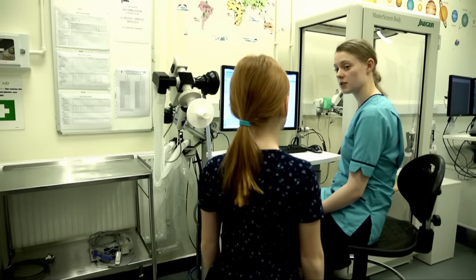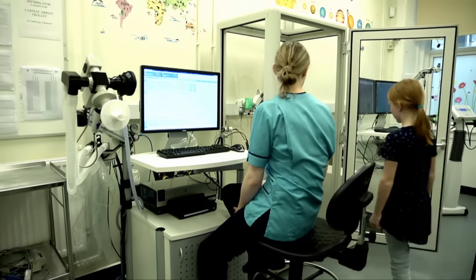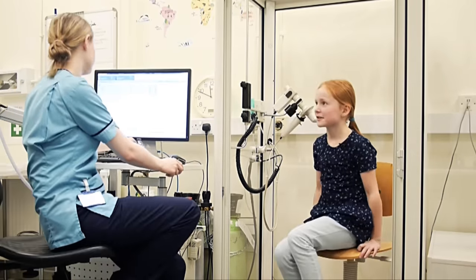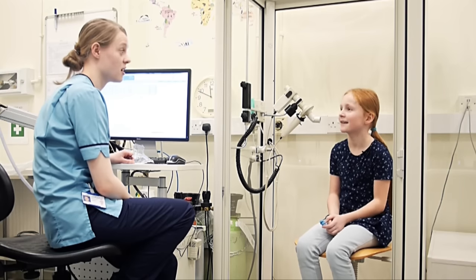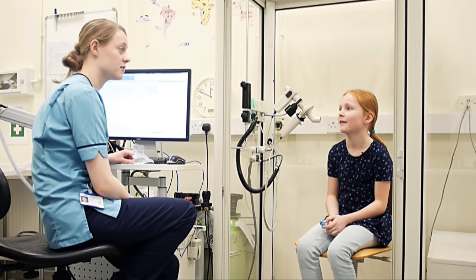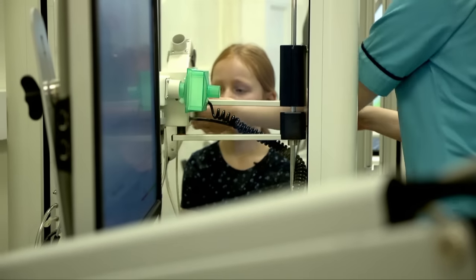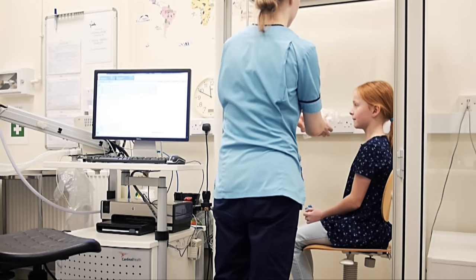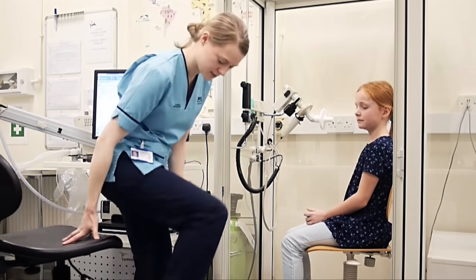So I'll get you to come across and have a seat in this box. Okay, have a wee seat up there for me. This box looks a bit like a TARDIS. What is it for? Well, the box allows us to measure how big your lungs are and how well different parts of your lungs are working. So if you want to turn around and face the other way, and I'm going to put this mouthpiece in for you.